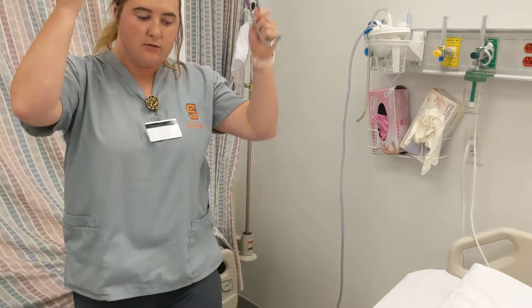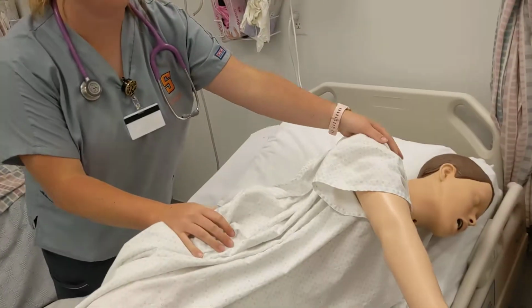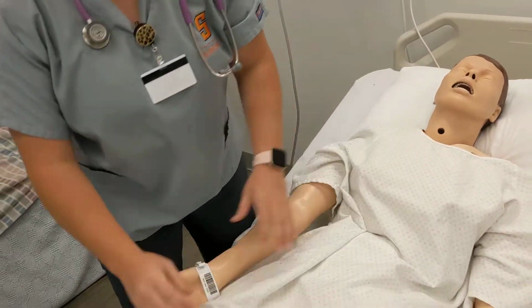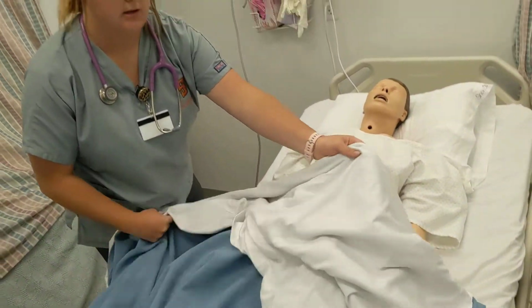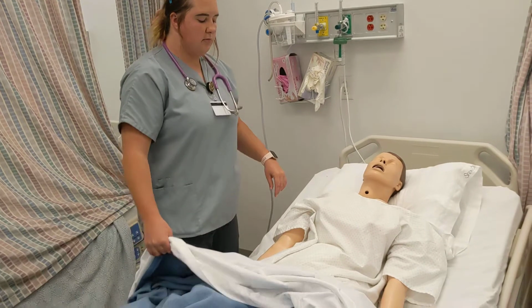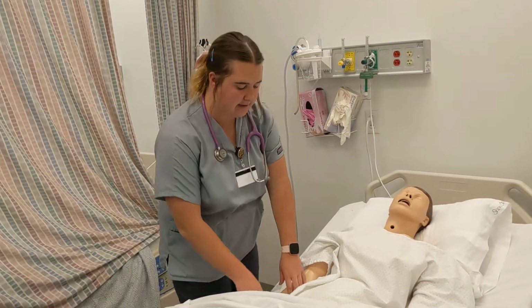Okay, so those sounded really well. Patient tolerated being on her side for a few moments well. I'm just gonna help her get back comfortable. So that sounded good. So now I'm going to move on to her abdominal section.